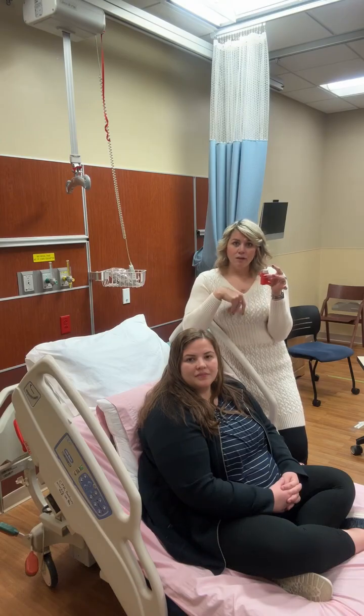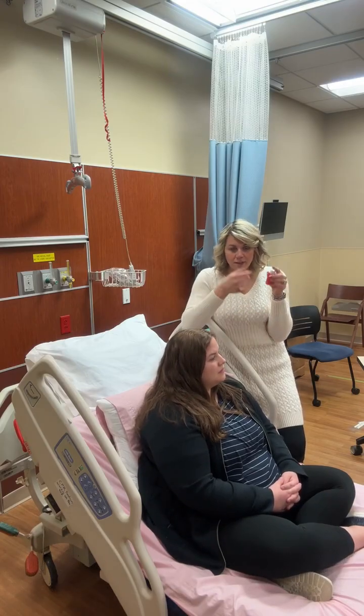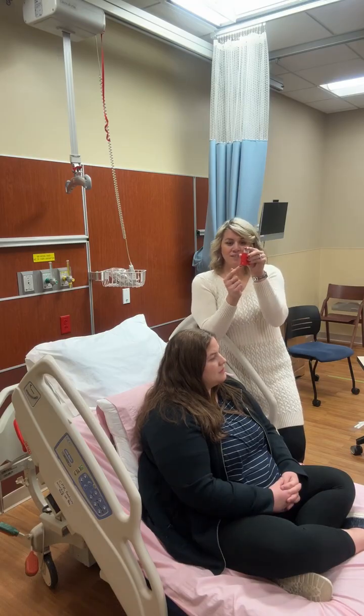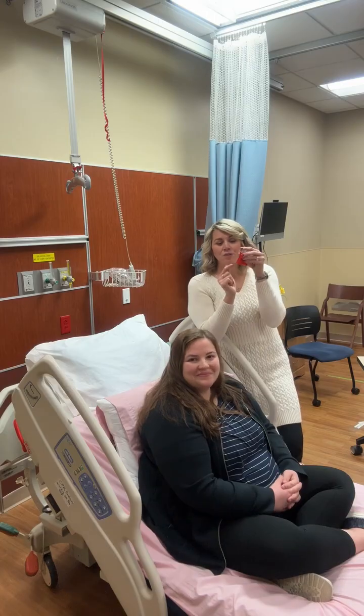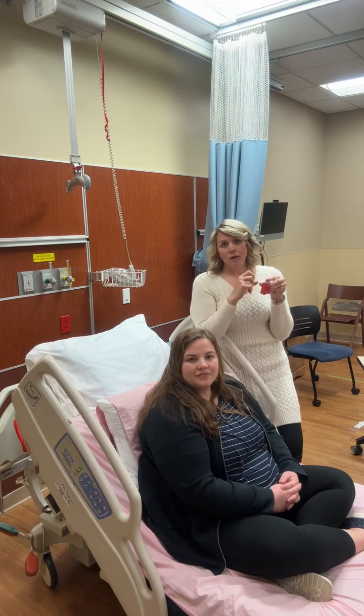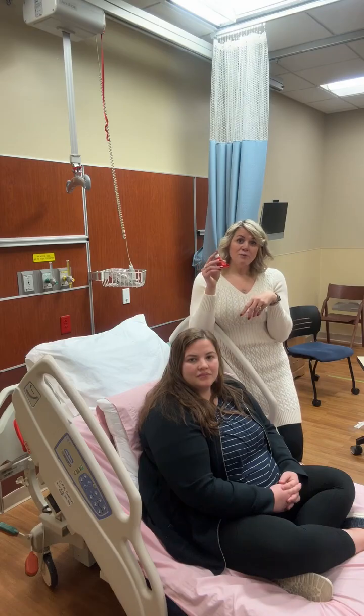So what I tell people is, if they were ordered, let's say, 184 doses, I would look back here and it says 182. I know you can't see it, but I'm telling you there are 182 doses on here. That means it was already primed twice. Two doses were used, and that is something you'll see on the counters. So let's say the medication has been primed and is ready to be given.